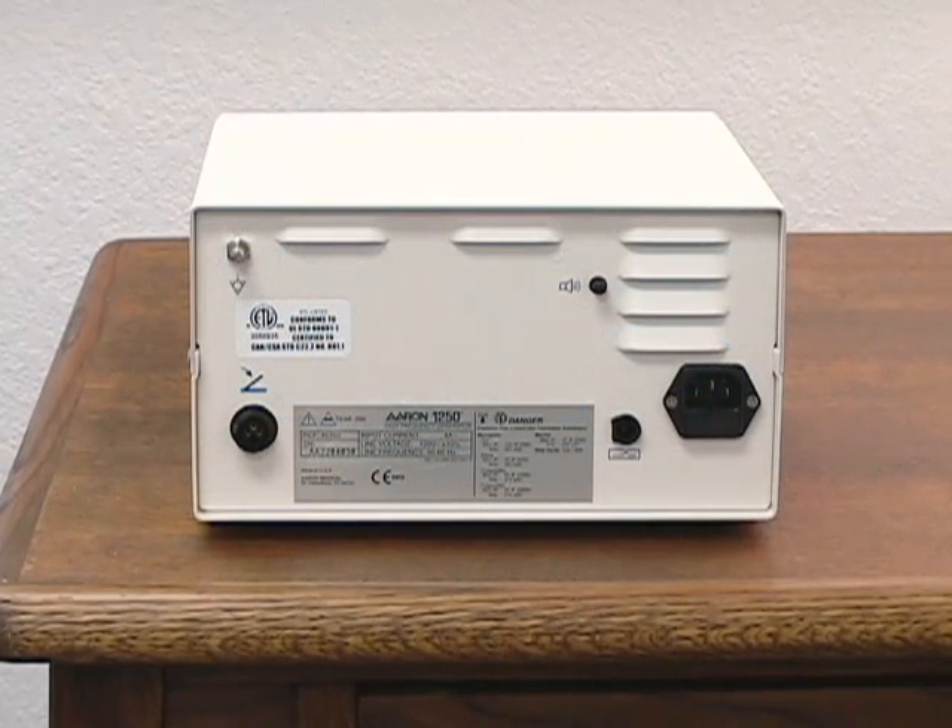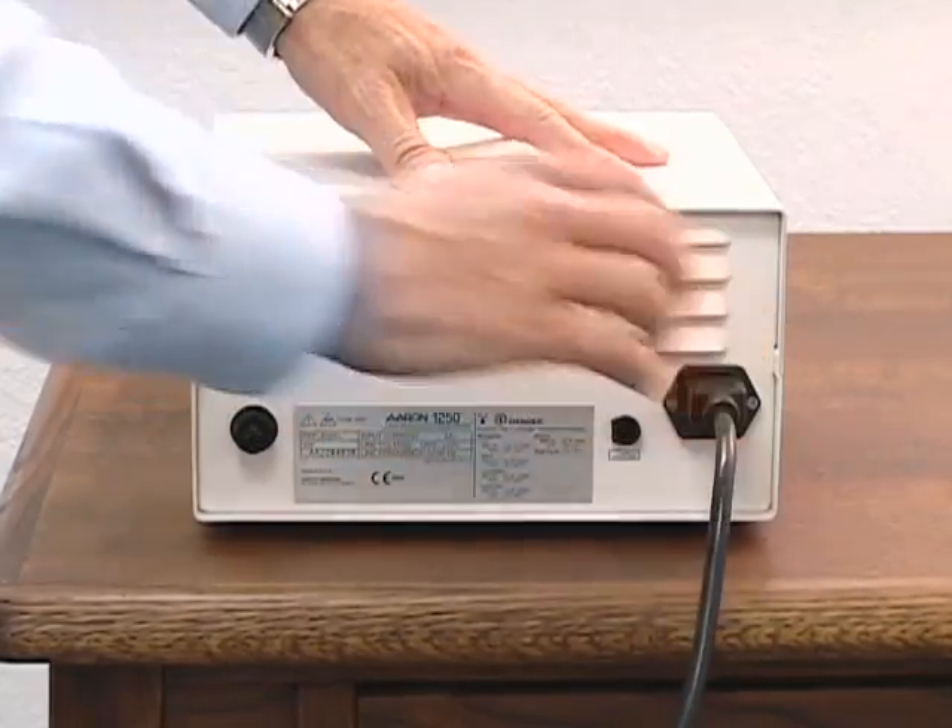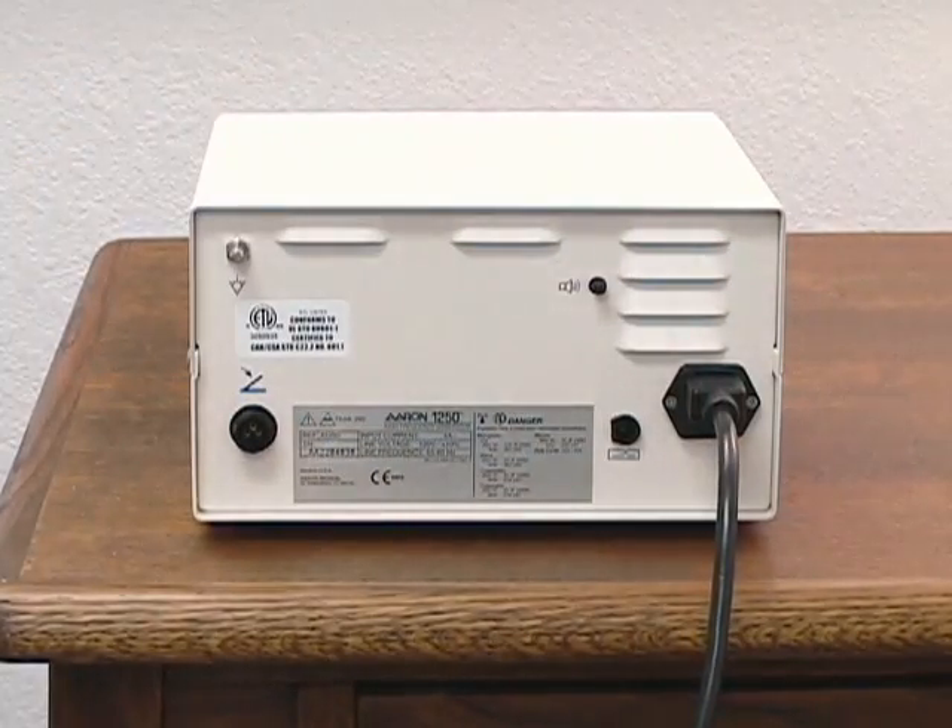To attach a power cord, place the unit on a sturdy flat surface, ensure that the power switch is in the off position, insert the hospital grade power cord into the back of the unit and the other end into a properly grounded AC outlet.